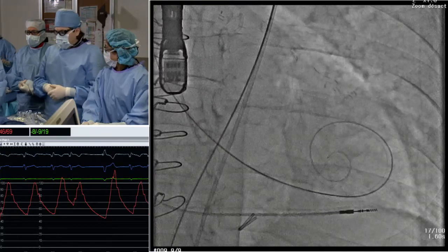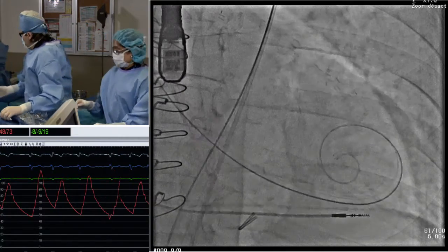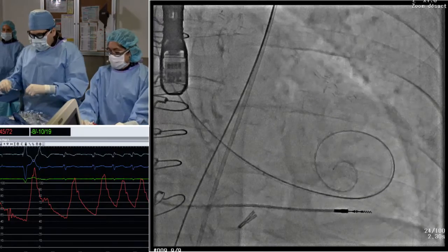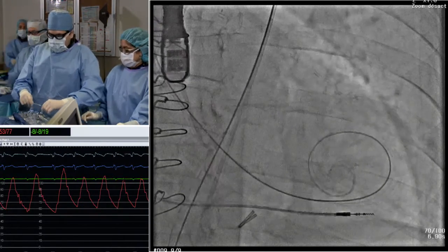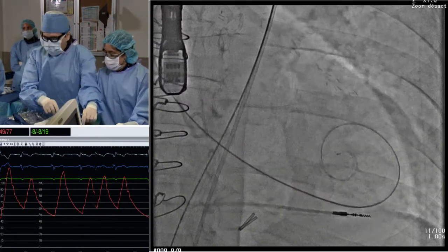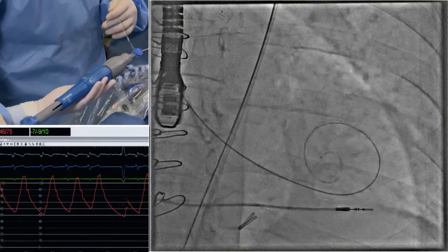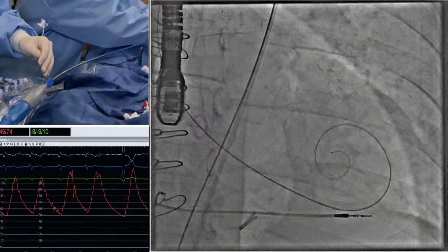Maybe I would like to have Dr. Cartier's opinion about the approach. No, I'm not a TAVI person. I was just a bit surprised that with those iliac and abdominal aortic aneurysms that would still be the preferred way of deployment, to go transfemoral. Probably alone in my train of thoughts, but I just wanted to have Dr. Cartier's idea whether he would be concerned about embolizations from the abdominal aorta.